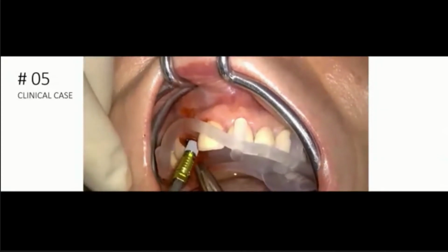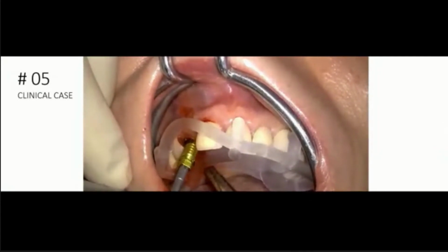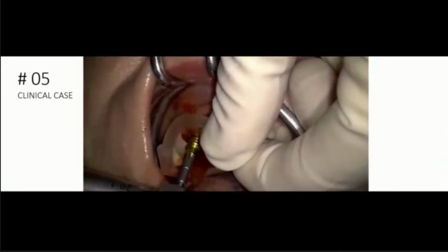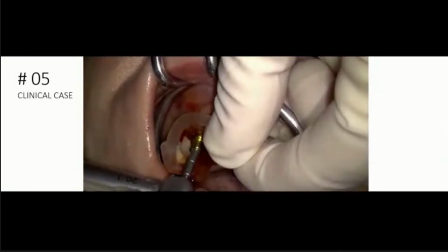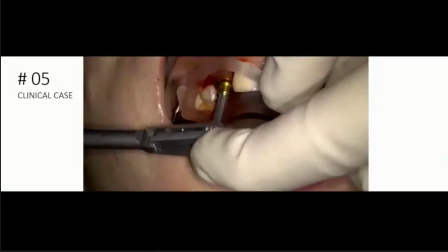Then the implant placement, everything guided to have the right position. This all with 15 Newton centimeters.